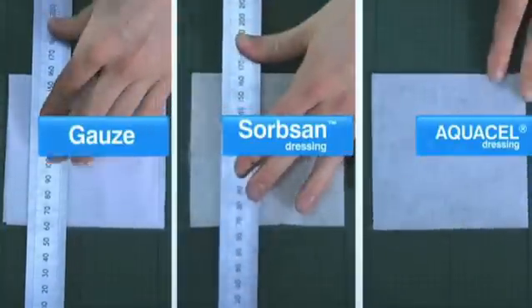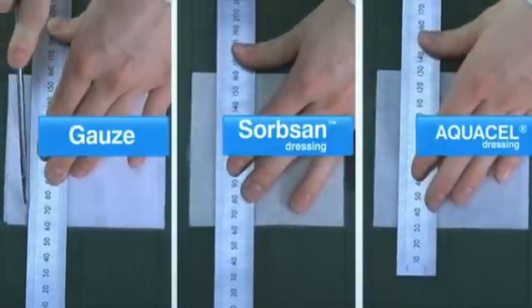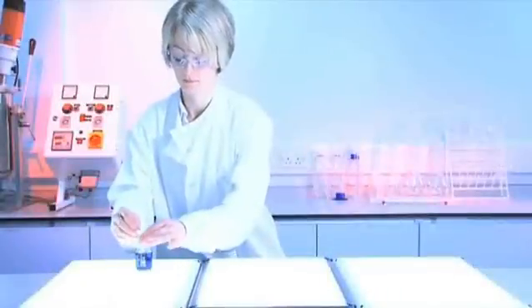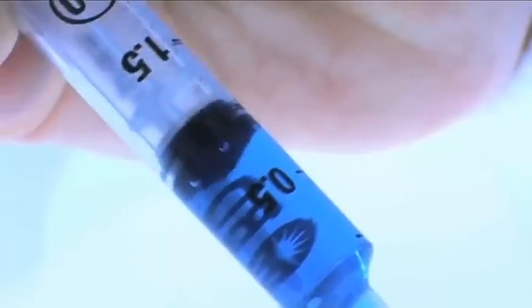We cut a 1.5cm x 10cm sample from each product in the machine direction. For the gauze, four layers are cut together to be comparable to Aquacel dressing and Sorbzan.